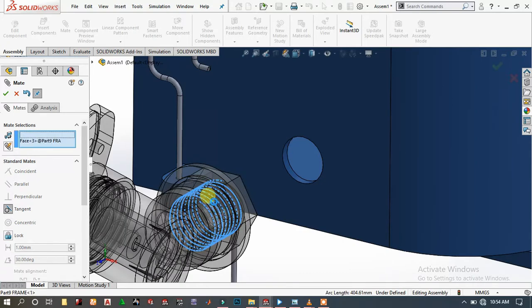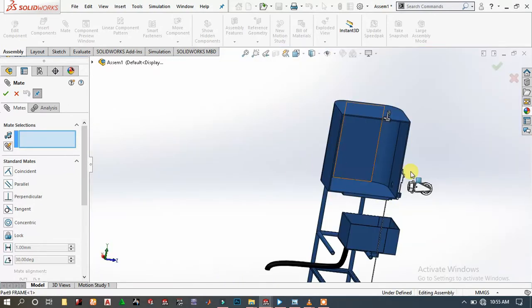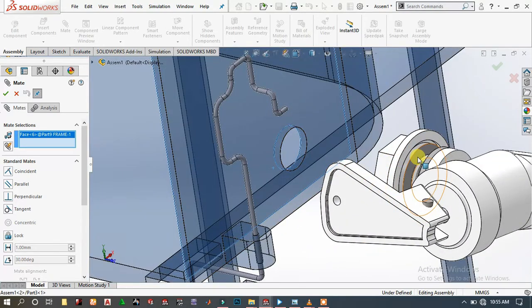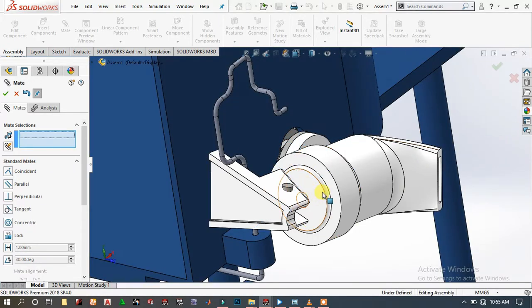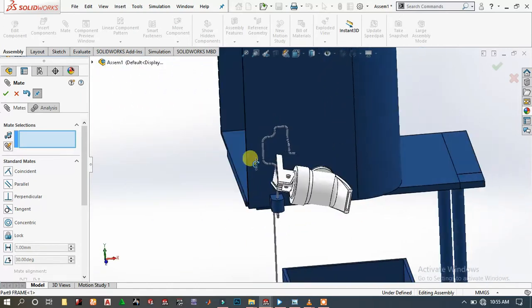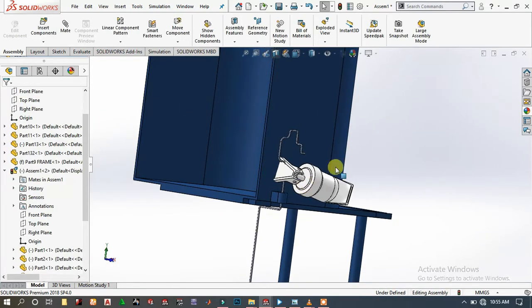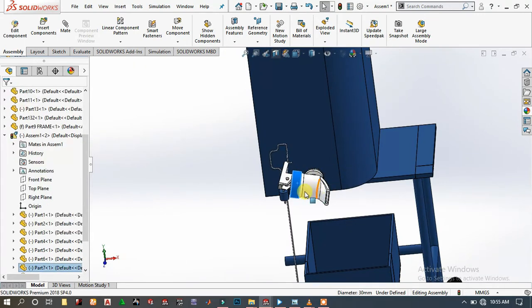Oh, it's the wrong mate selection, so delete them. Choose this face and this, then click OK. Try to adjust it in the right direction. First exit mate and try to rotate it.